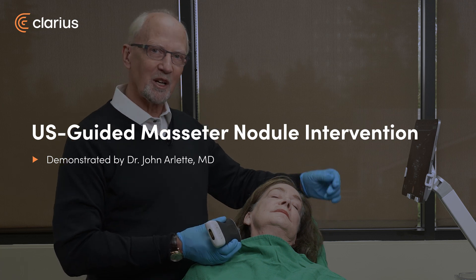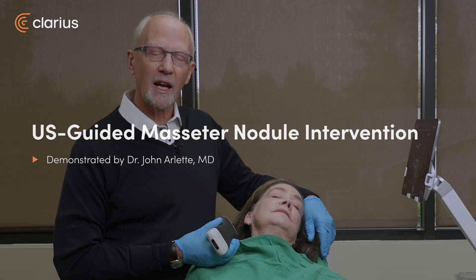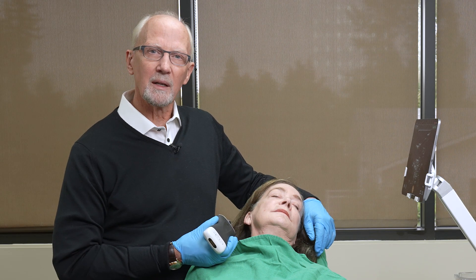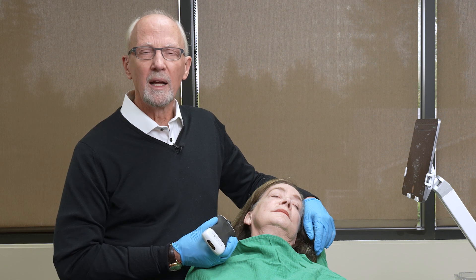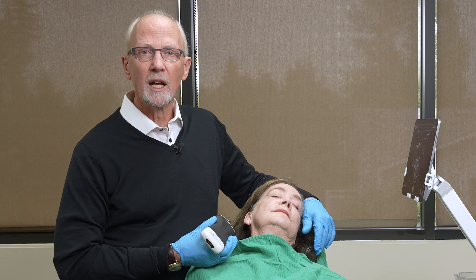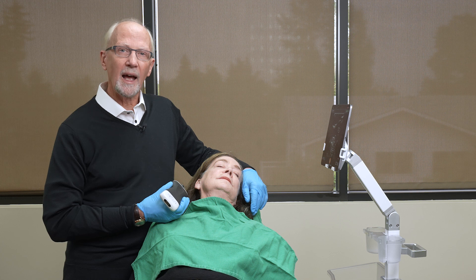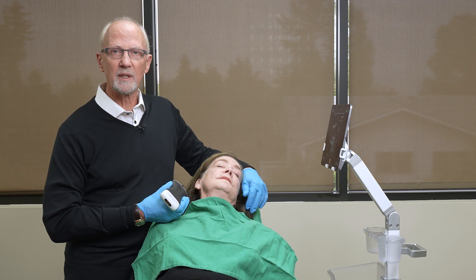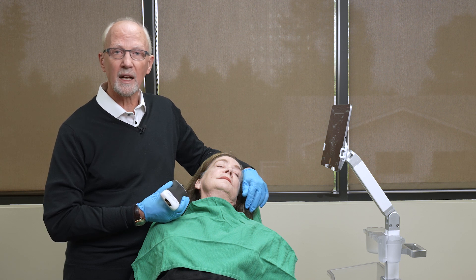Good morning. I'm John Arlette and we're here today to examine a change below this patient's masseter. She had some filler placed in this area in order to re-drape the jaw and developed a localized change which we've aspirated and shown no bacteria in. It's been cultured on two occasions and it has gone down. She initially had some difficulty opening her mouth and some local discomfort that has now faded.